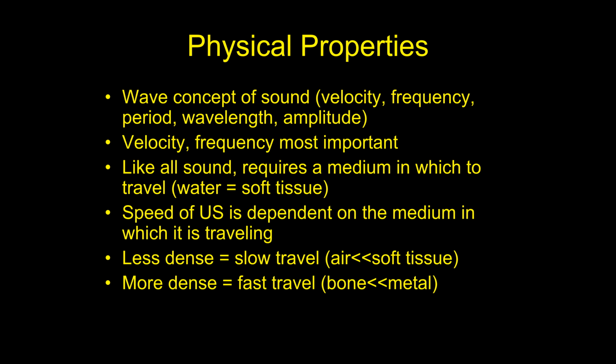For ultrasound, though, we can simplify that, and we only have to worry about the sound waves with ultrasound only having a velocity and a frequency. Like all sound, it has to have a medium in which it travels. Again, if you were here in my office and I'm talking to you, the medium in which that sound is going from my mouth to your ears is air. And we know that air is made up of nitrogen and oxygen, a little bit of helium, a little bit of other stuff too, right?